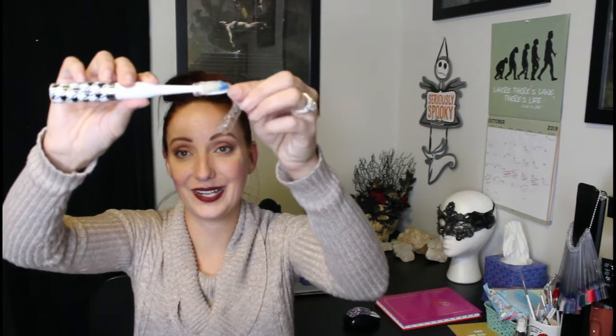And my other things that are in my bag, I have toothpaste. This is my travel toothbrush. It has soft bristles, but they're a little flatter, and it is an electric toothbrush, so it vibrates a little bit, which makes it a little easier to clean. But I found that this particular toothbrush is extremely narrow right here, so it fits inside really well. My original toothbrush is an Oral-B one, and the head is much fatter, and I wasn't able to get in and brush.